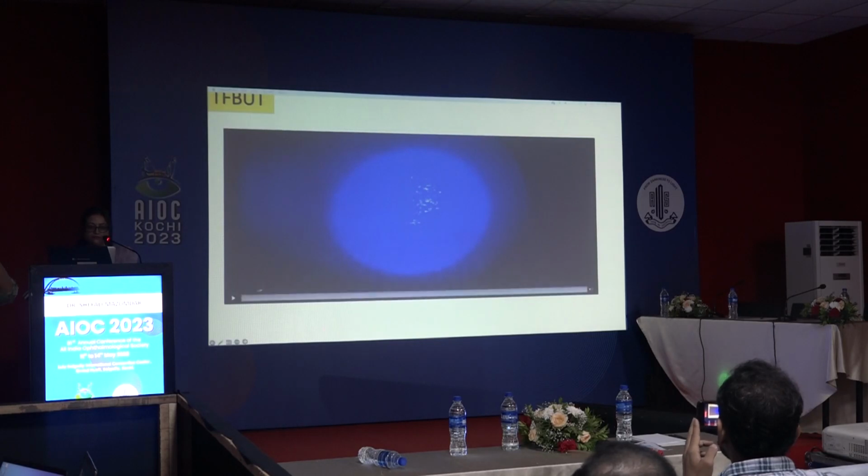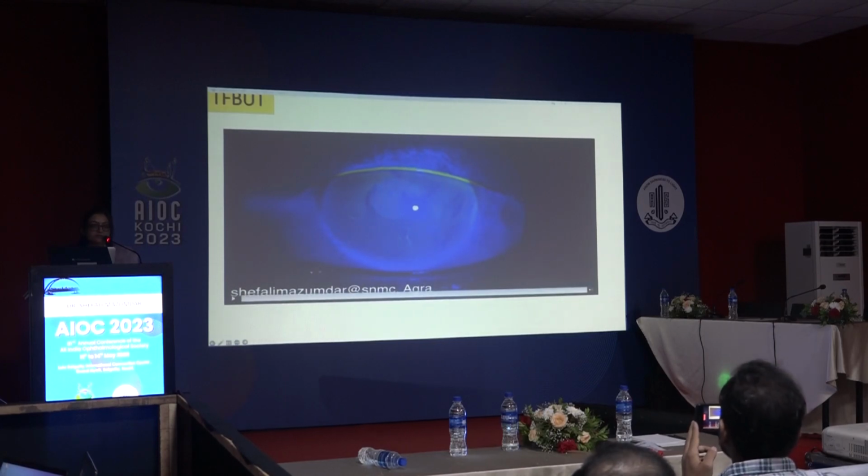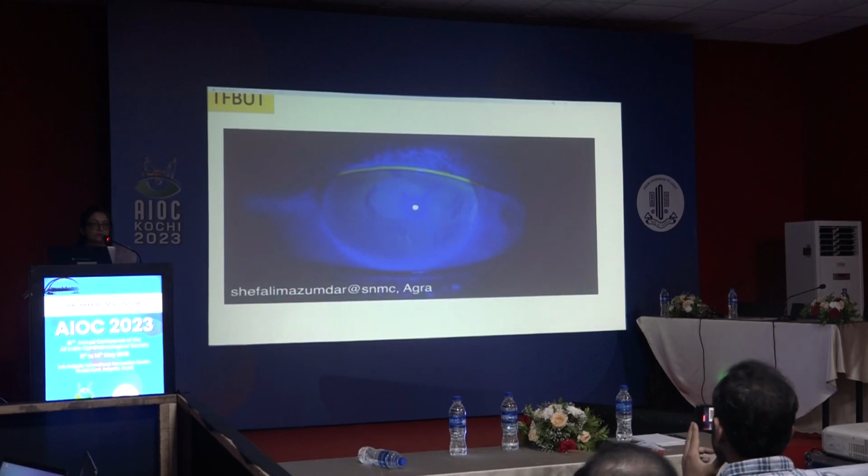Now another one. If you look carefully, these are the dry spots. Okay, so here in this case it was 3 seconds. So in this case the tear film breakup time was low, and you will have to repeat this test at least 3 times, then you take the average of it.